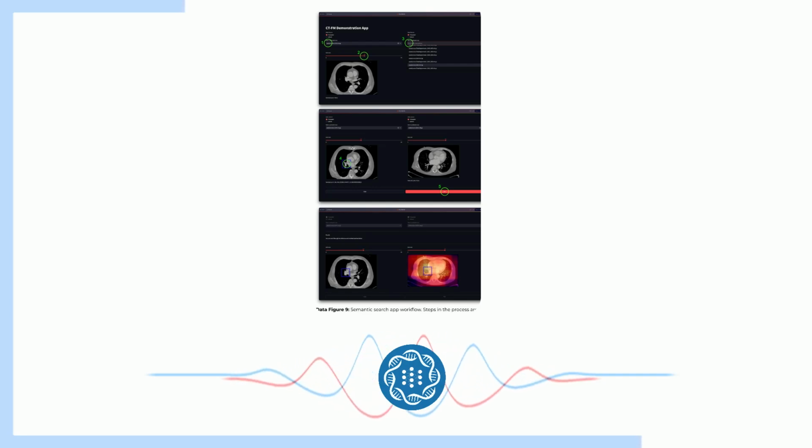It's like it's not just seeing individual pixels, it's understanding the underlying building blocks of the body. Yeah, it's really pretty amazing. And this isn't just theoretical, right? You mentioned earlier that CTFM can search for similar regions across different scans. How does this color coding system play into that? Right, so it's all connected. Remember those semantic concept searches where you can select a region of interest in one scan and CTFM will find other scans with similar regions?